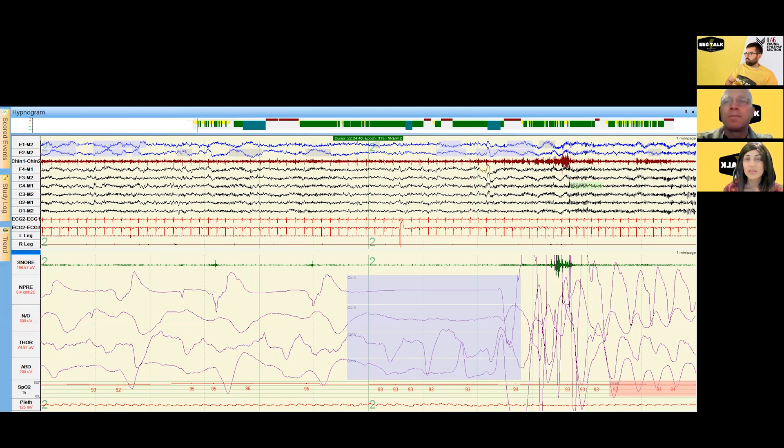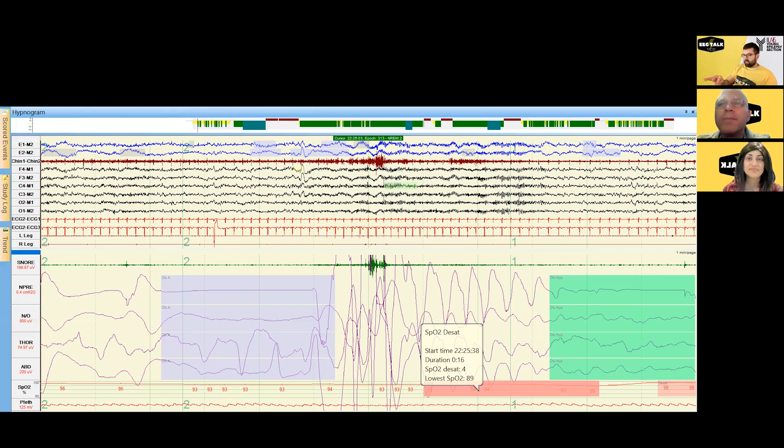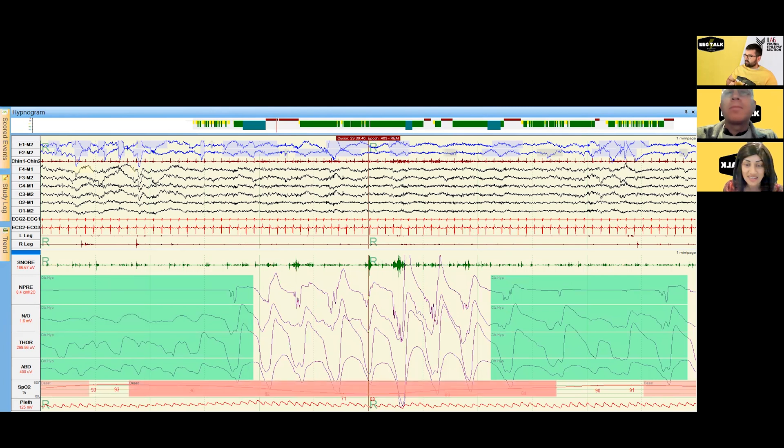In central apneas we see a likely lack of central drive to breathe. There also seems to be an altered arousal threshold for patients with obstructive sleep apnea — sometimes they don't wake up as easily, sometimes too easily. Fabio feels pretty tired, which is attributable to this. It's that crescendo of respiratory effort that then causes the cortical arousal as we page through the study.